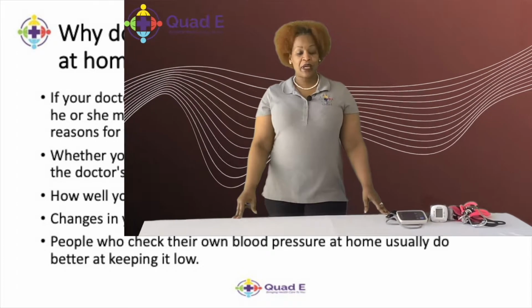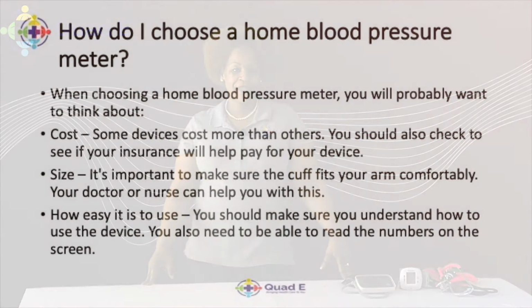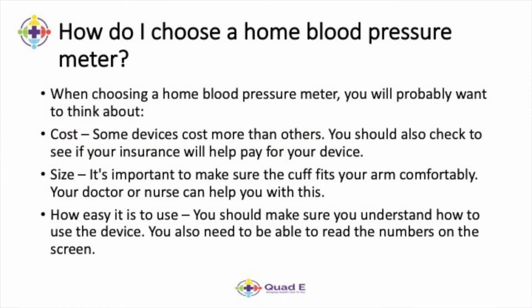When choosing a blood pressure meter, you would want to think about a couple of different things, okay? So cost, size, and how easy it is to use. Some devices cost a little bit more than others, but check with your insurance because they may be able to cover it. That way you won't have to come out of pocket at all.